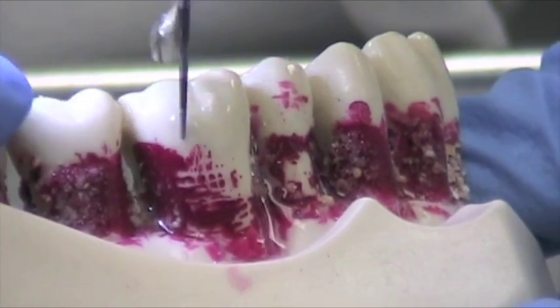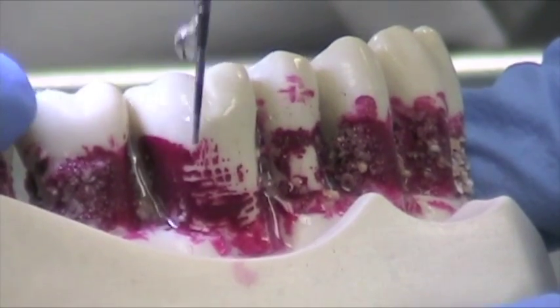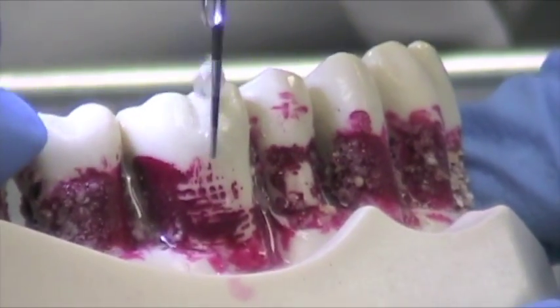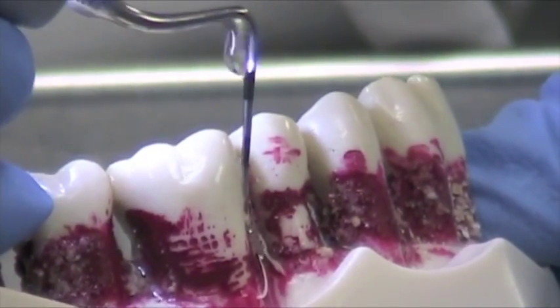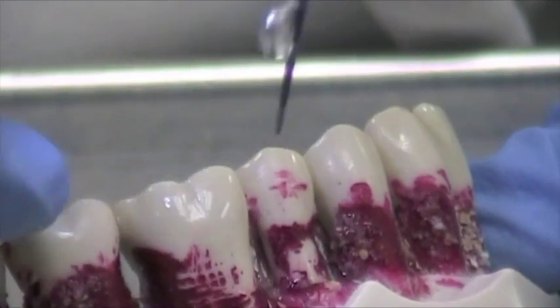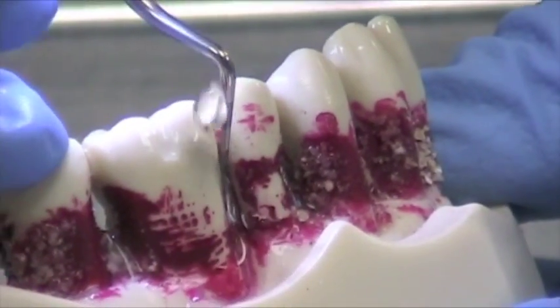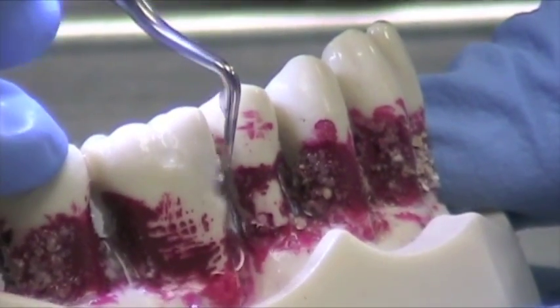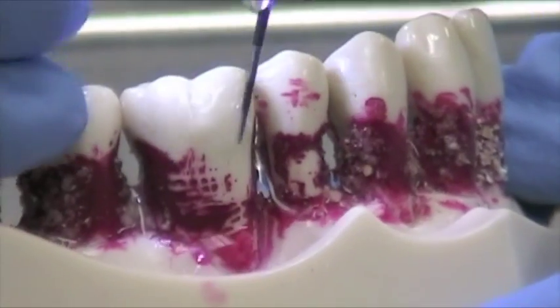Very, very light sweeping strokes. This is non-bladed, doesn't have any diamond coating. It's not for calculus removal — it's for biofilm disruption. When you go into the interproximal areas, you can turn your angle, drop by drop irrigation, again using a fulcrum.